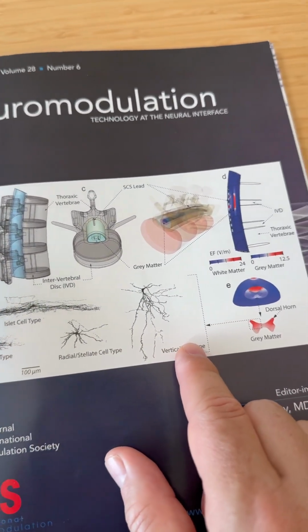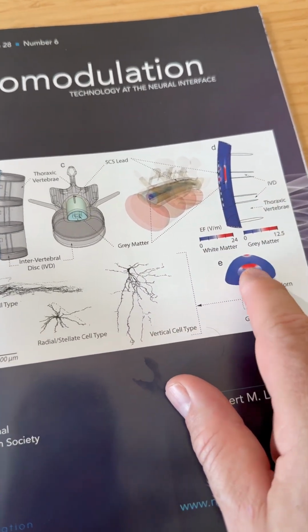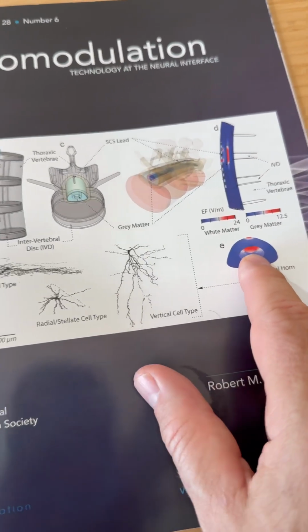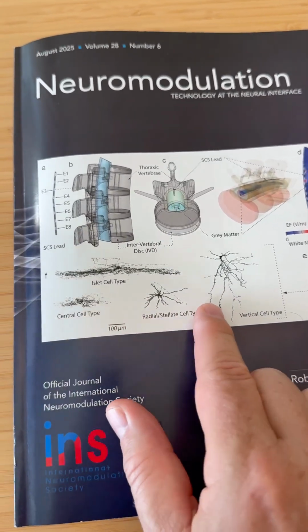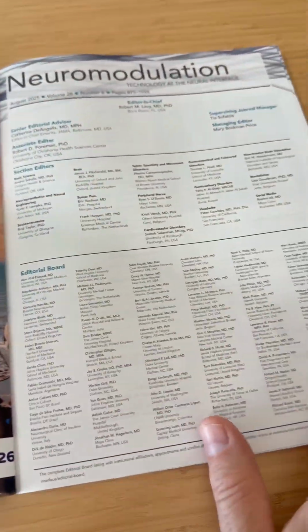And so the main question we had is, of the current during spinal cord stimulation that enters the spinal cord, so there is some current flow generated here, how much would these cells polarize? Will they polarize almost no millivolts, some millivolts, and so on? And so that's what we did. And I can briefly summarize what we found.